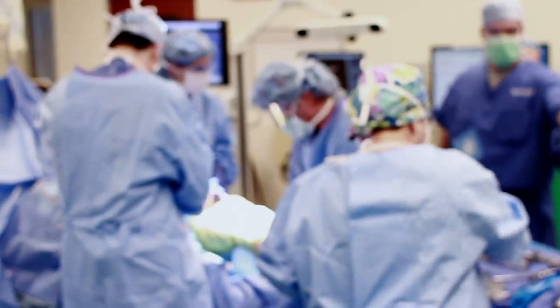With this Makeoplasty robotic arm-assisted technology, I know that what I plan to do in the OR, I'm going to accomplish that. I can feel good about that, and I know I can tell my patients that with certainty. I'm going to give you an almost perfect knee, an almost perfect resurfacing every time.